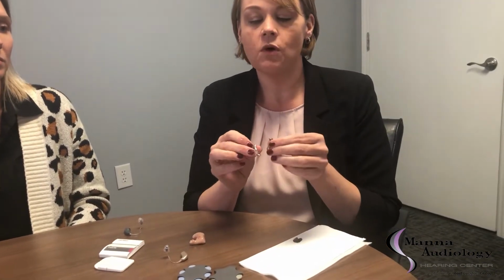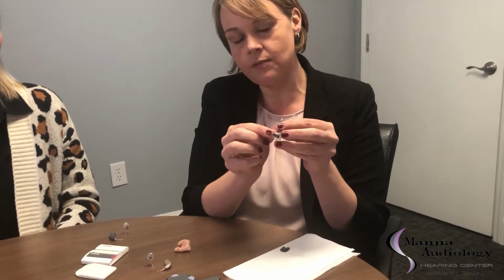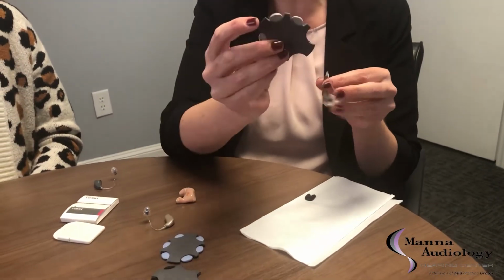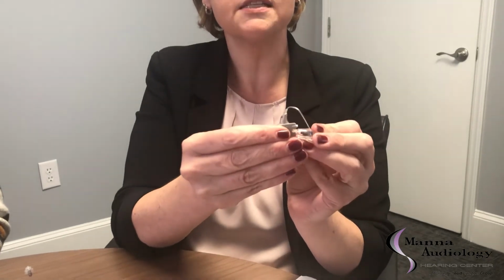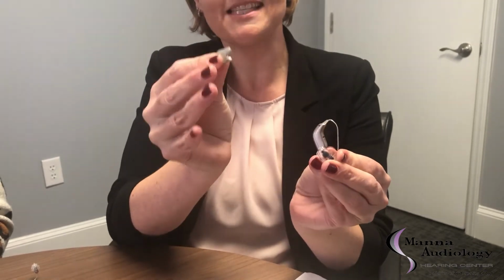Now, the second one I'm going to show is what we would call a custom receiver that's specifically made for your ear, and it actually takes a different size wax guard. So it looks very similar to the other ones, only you have a gray tab. So again, you pull the little gray tab off. You're gonna take your removal tool here. You're gonna snap it right into place. You'll pull that guy out and slide the replacement right in, okay?